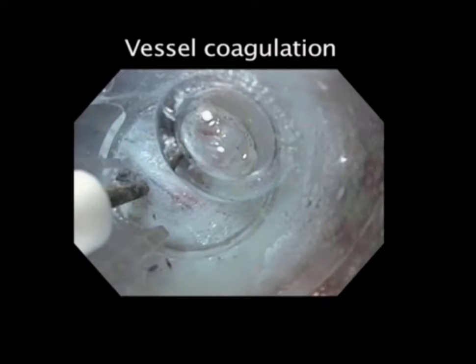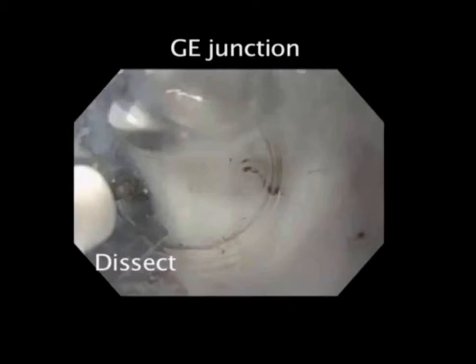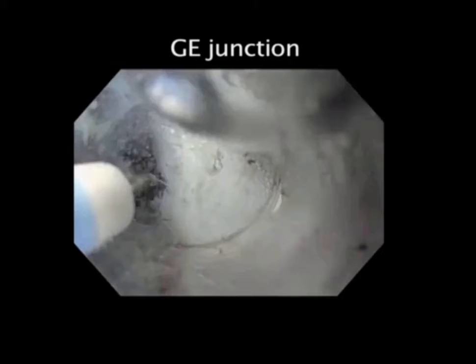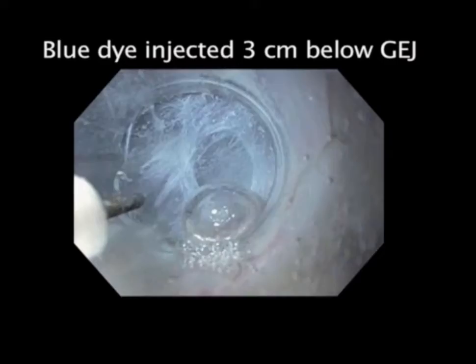As we get to the GE junction, the submucosal space narrows, so we have to more generously expand that submucosal space. We stay close to the muscularis propria to avoid any injury of the mucosa. As we get below the GE junction, the submucosal space opens up. Three centimeters below the GE junction, we inject blue dye.